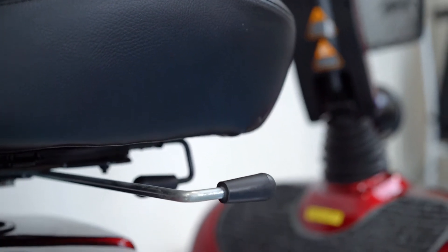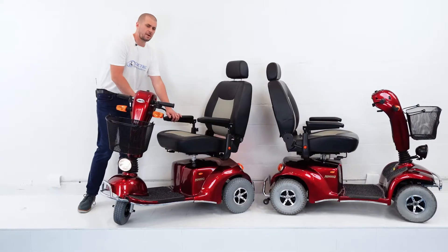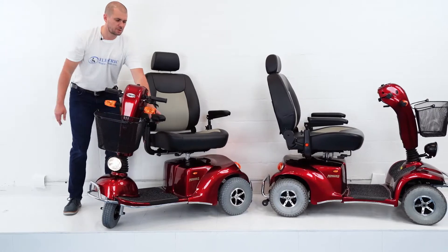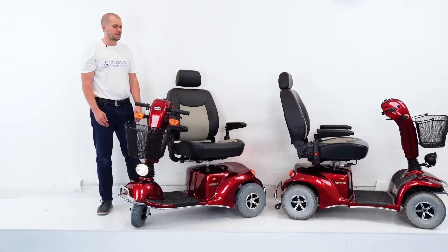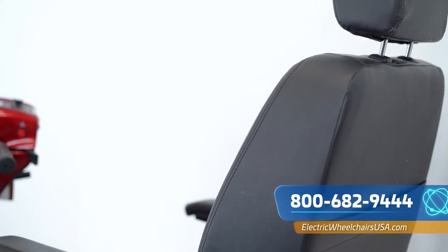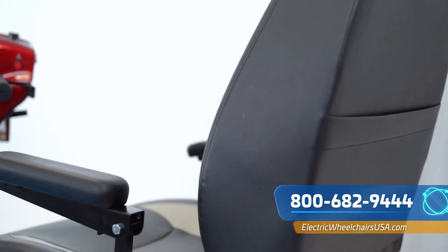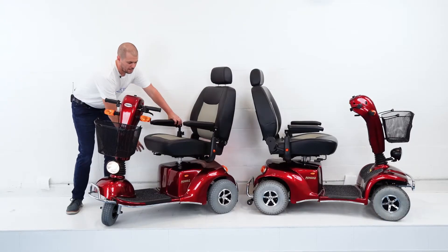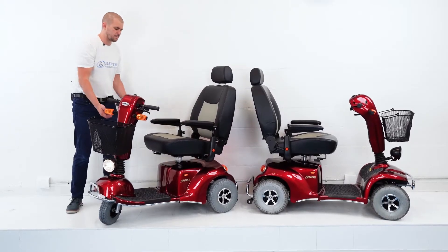The captain seat can swivel to the side — there's a lever on the right side at the bottom. If you pull it up, you can swivel the seat to the side. This is great if you're going out to eat with your family: pull up to the table, swivel the seat to the side, and eat right with your family. It's easy to pull it right back into the driving position.